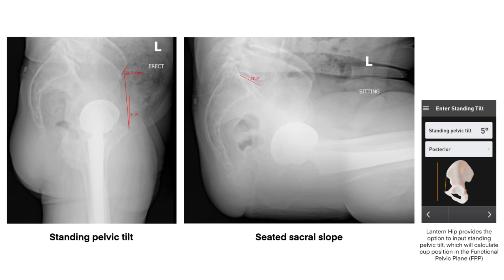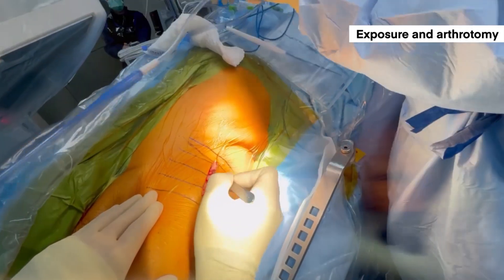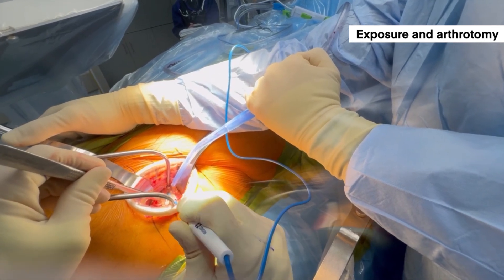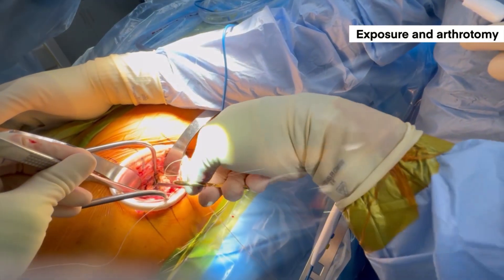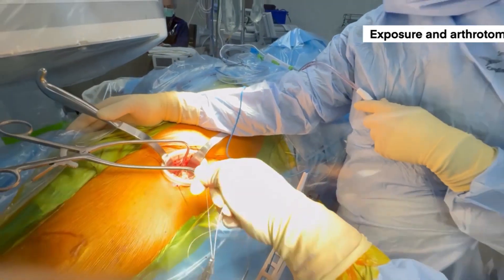Given the relative neutral position of the patient's functional pelvic position, the importance here is just to improve the accuracy of our component positioning. The setup for the Lantern Hip is relatively simple. I typically perform my prep and drape as I standardly would, and use my standard approach to an anterior hip. It's important to prep out the ipsilateral iliac crest for pin placement and to prep distally enough for the thigh mount to be placed for later registration.